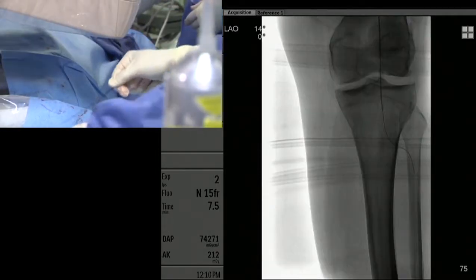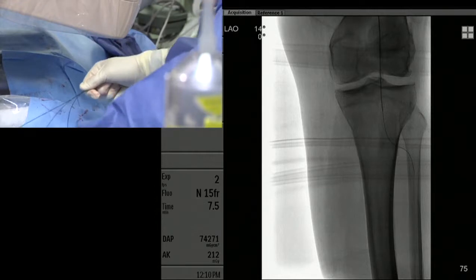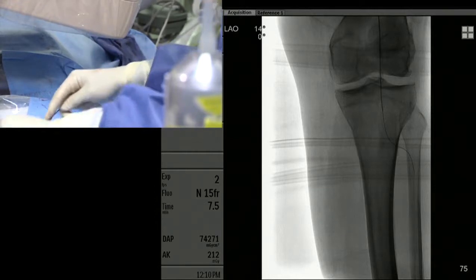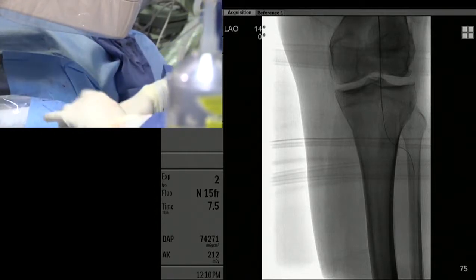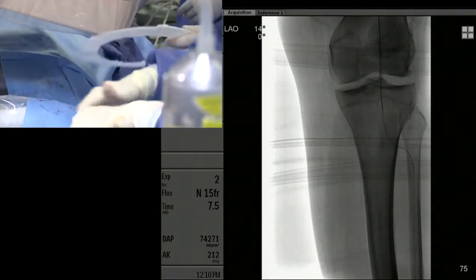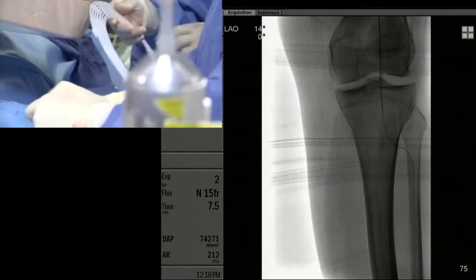Go ahead and take the Viper wire. This is a 420-length Viper wire. Send the wire down to the peroneal. That wire is now in the peroneal.